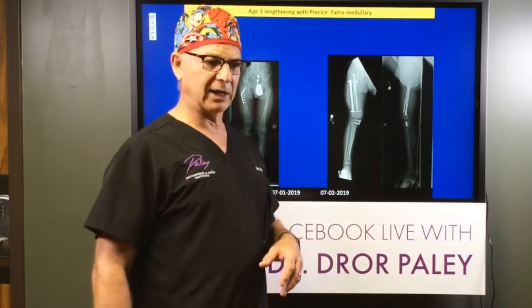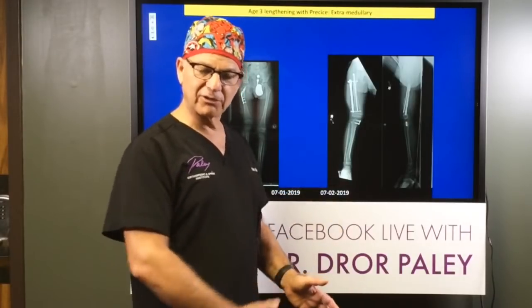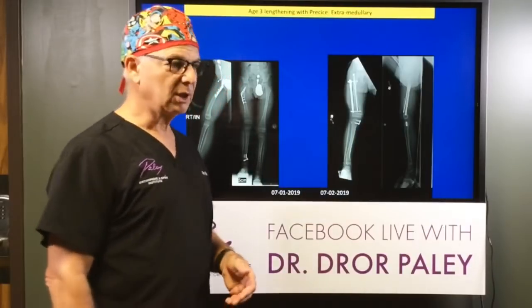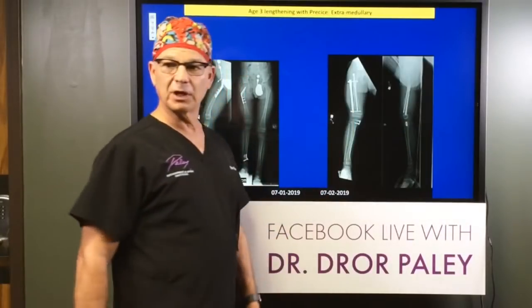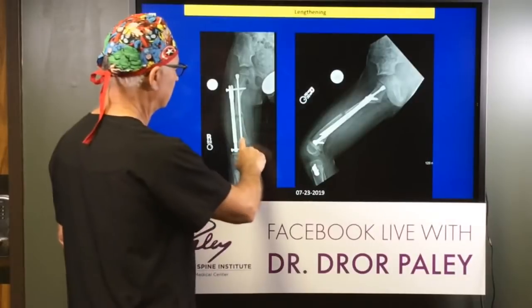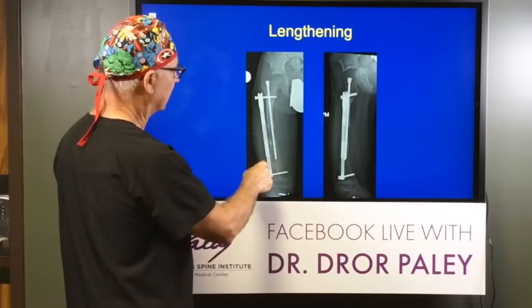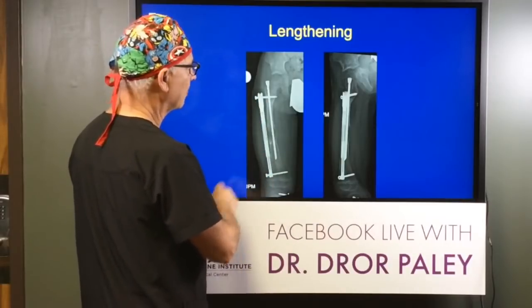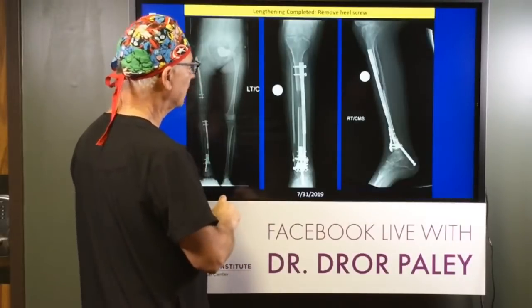Well, the thing is, there's lots of patients where the inside of the bone is too narrow. And so we need something that fits on the surface of the bone. The other thing is, in the tibia, to put these devices in, you have to go through the growth plate. So you don't want to damage a growth plate in a young child. So going on the surface of the bone, you stay away from the growth plates. So a lengthening plate has a huge advantage.